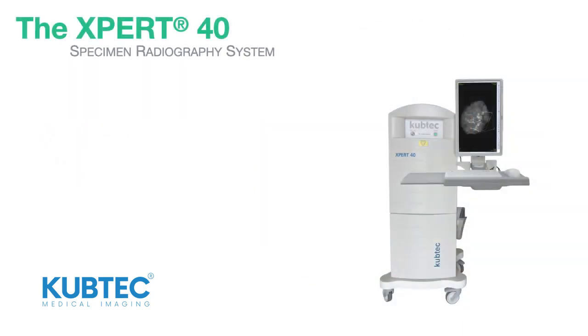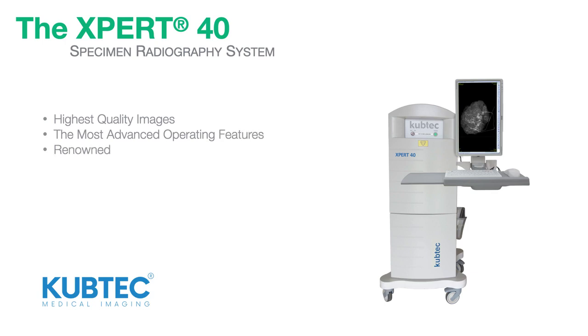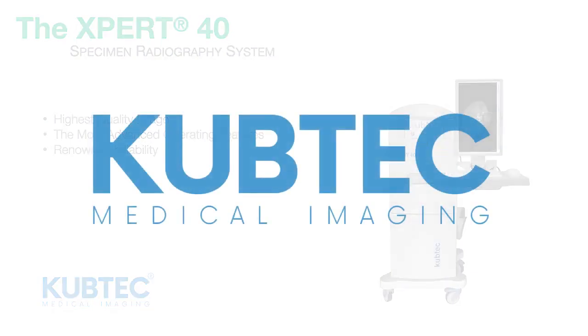The XPERT 40 system. The highest quality images. The most advanced operating features. Renowned reliability. Only from Kubtec.